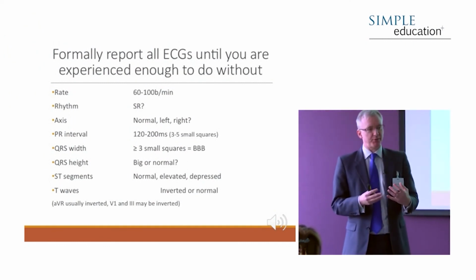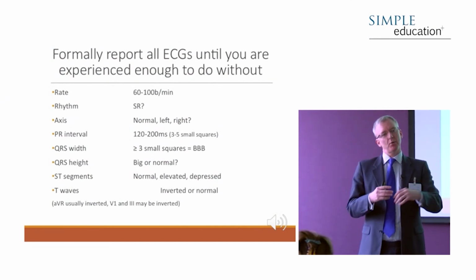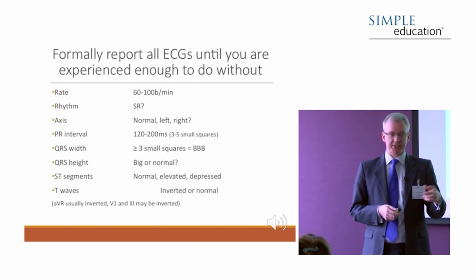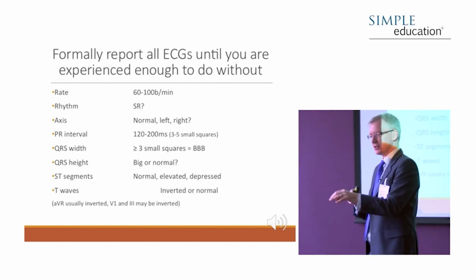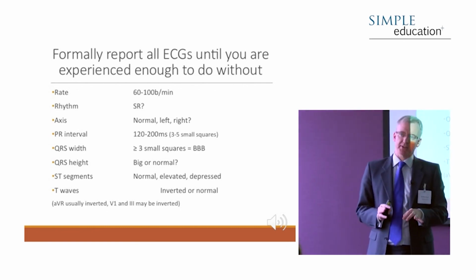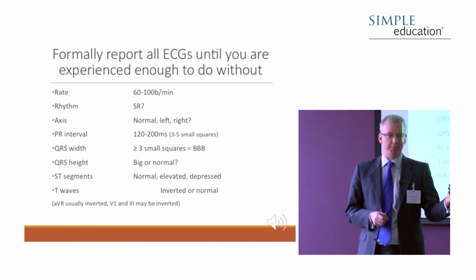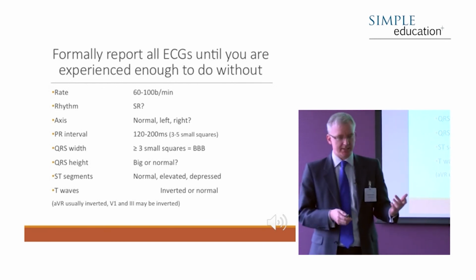So the methods taught for establishing a cardiac axis are orthodox. A lot of medical schools will teach a moderately complex algorithm that people rapidly forget, particularly because there are 5, 6, 7, 8 different ways taught. So you get out of medical school and you've got moderate confidence, and then somebody teaches you a different way and you can't remember. So I'm going to teach you in a moment a simple way that gets most of it right. And we've taught over 2,000 doctors now, and not a single one of them leaves the room unable to get 98, 99% of people's cardiac axis right within about 3 seconds of looking at the ECG. So I'll show you that in a minute.